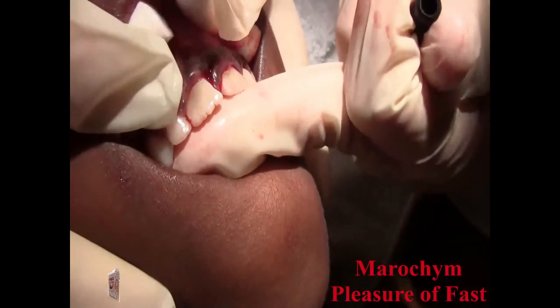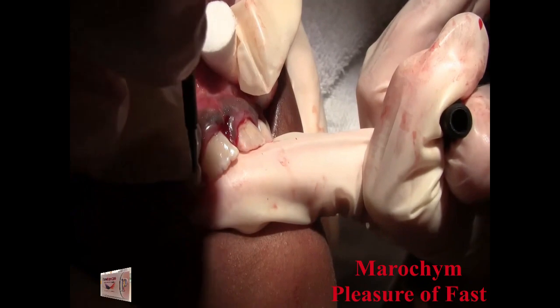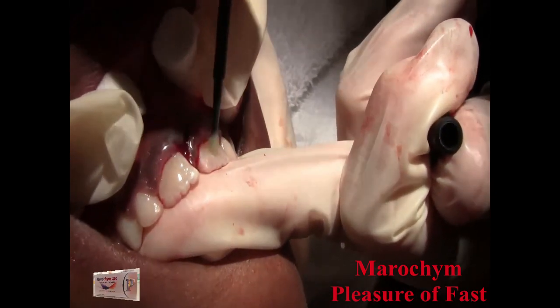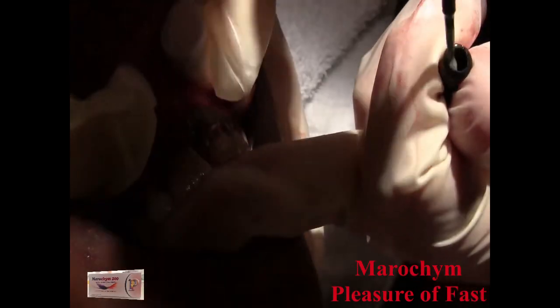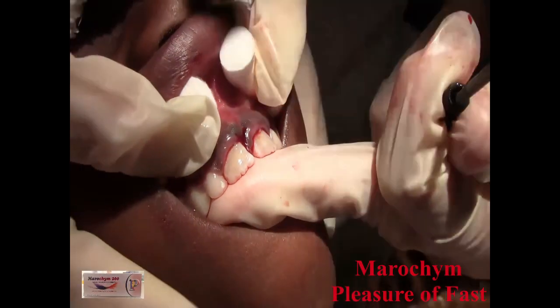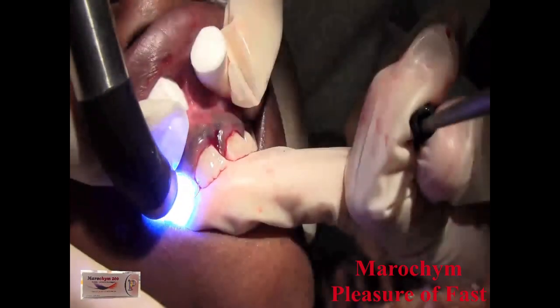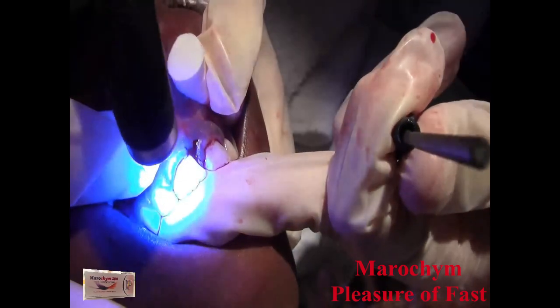It's just my fingers. You're just putting medicine on your teeth. That's all. No needle, okay? Fingers in your way there, right? They're okay. Now we're just drying them. Sounds like a little hair dryer. Got your eyes closed?